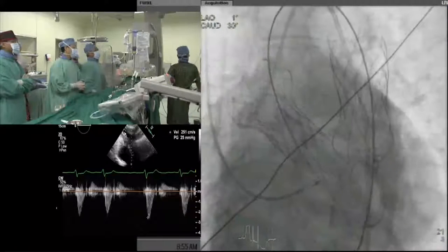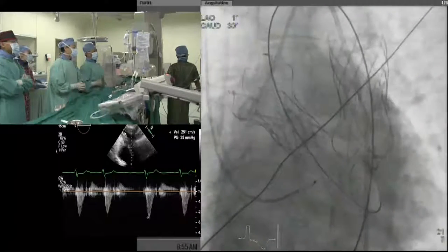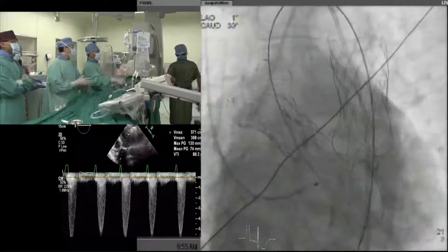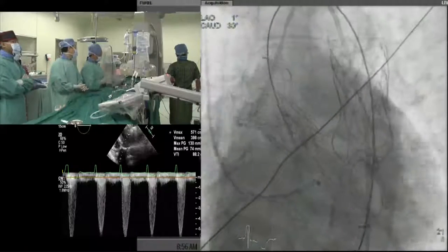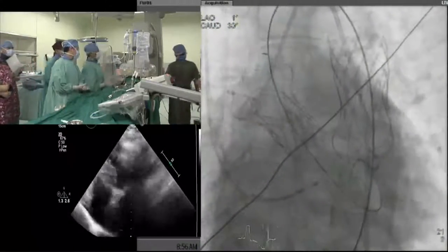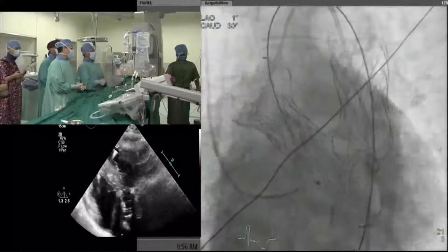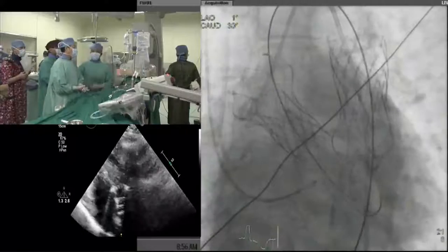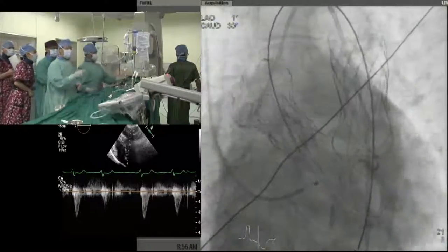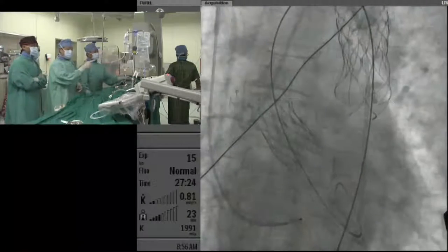It'd be nice to be perpendicular to the valve, the implant, because I think we're about 20 degrees off. You can see the valve velocity was very high, 5.7 meters per second. That's a caudal 30, maybe too much. Yeah, the projection is better. That's better. Okay. You're right.